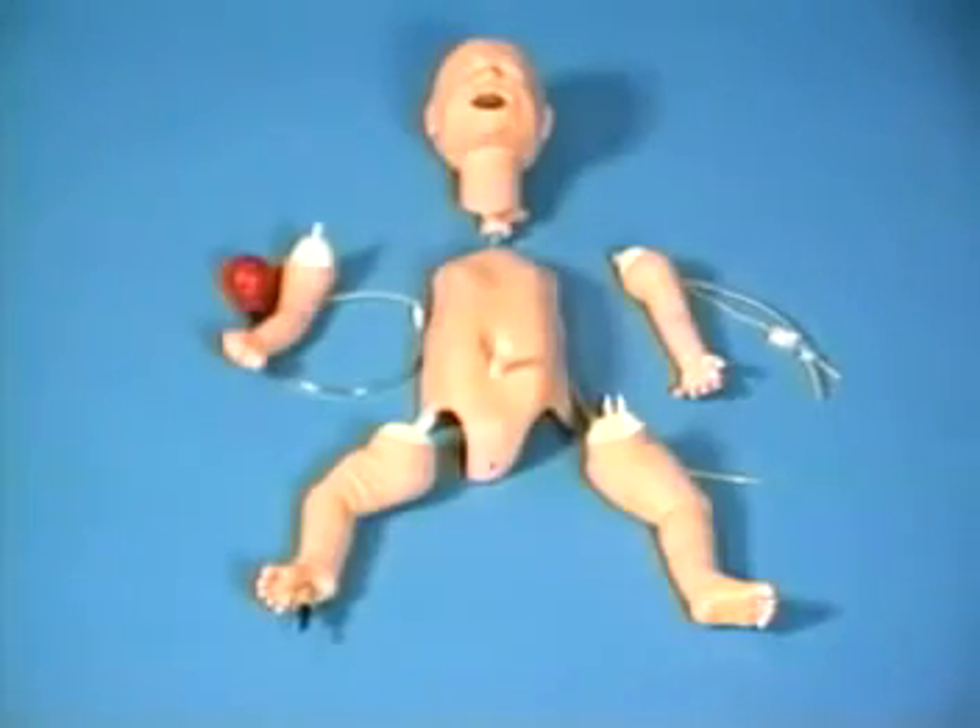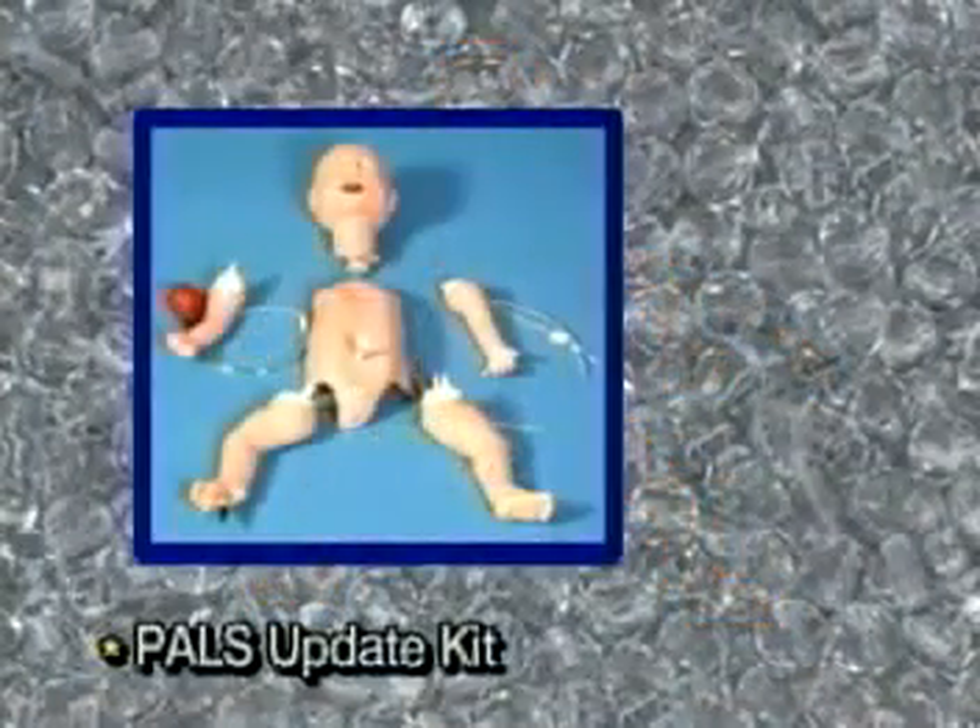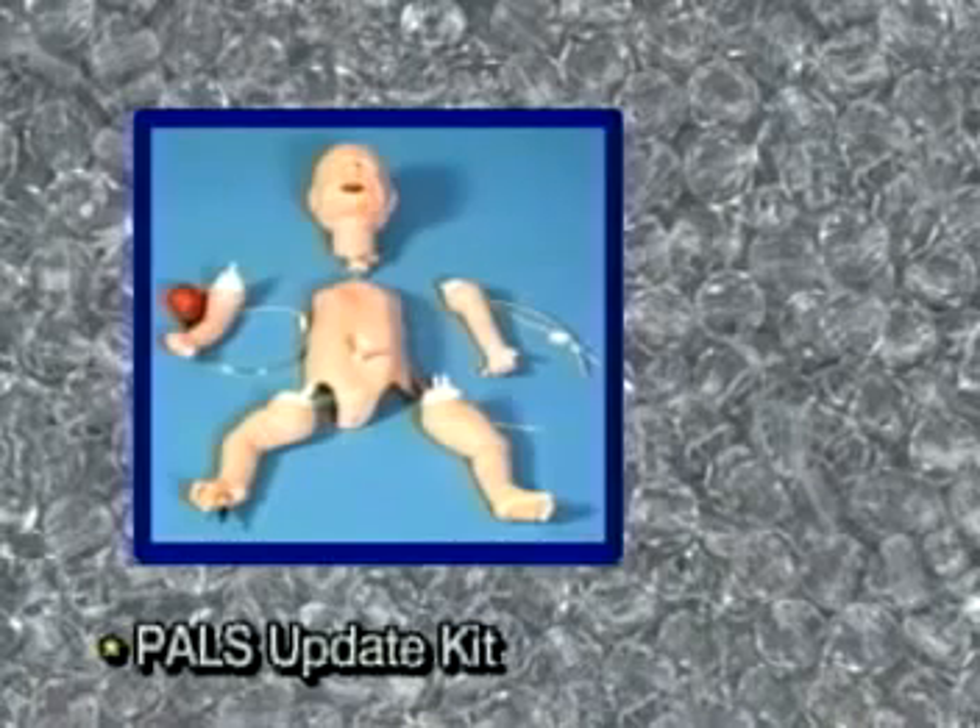LifeForm PALS kits and individual components are also available to transform old mannequins into state-of-the-art pediatric advanced life support mannequins.